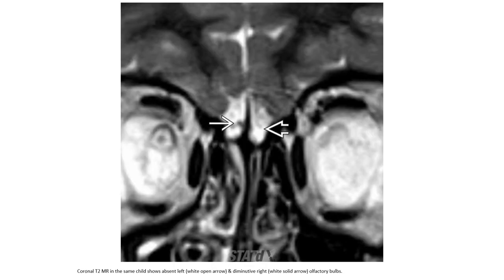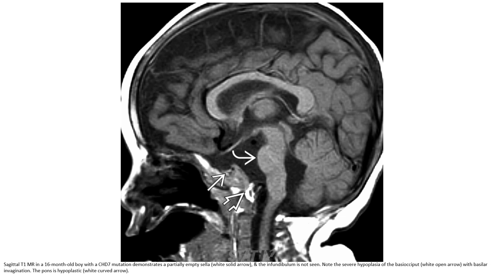T2 MRI in the same patient showed absent left and diminutive right olfactory bulbs. T2 MRI in a 16-month-old boy with CHD7 mutation demonstrated a partially empty sella, and the infundibulum is not seen. Note the severe hypoplasia of the basioccipital with basilar invagination. The pons is hypoplastic.